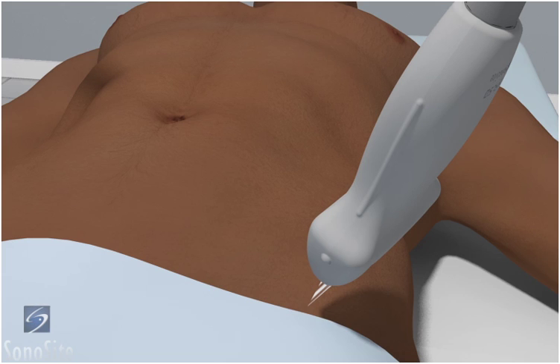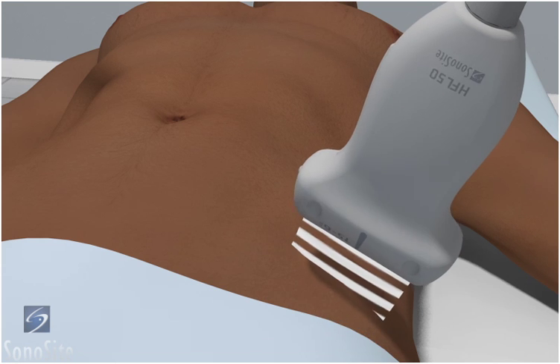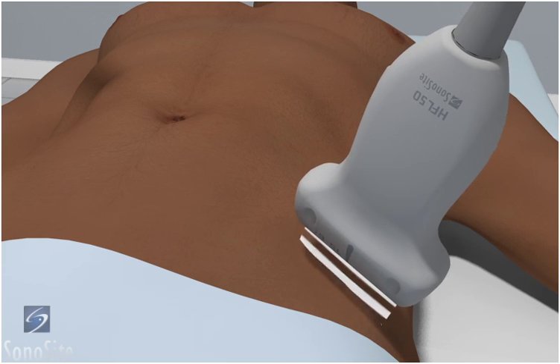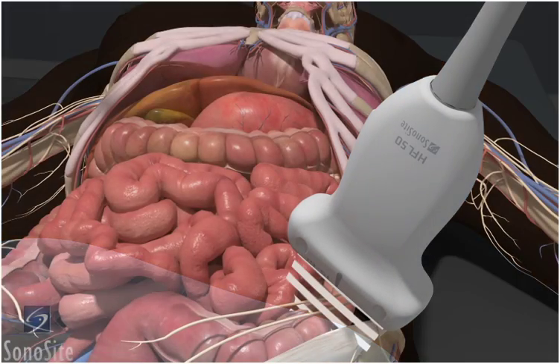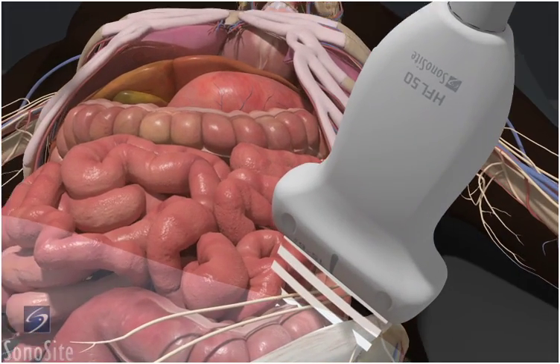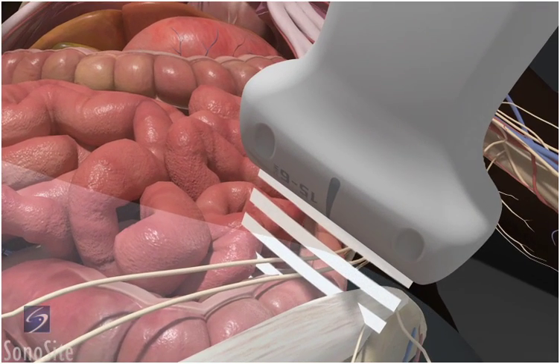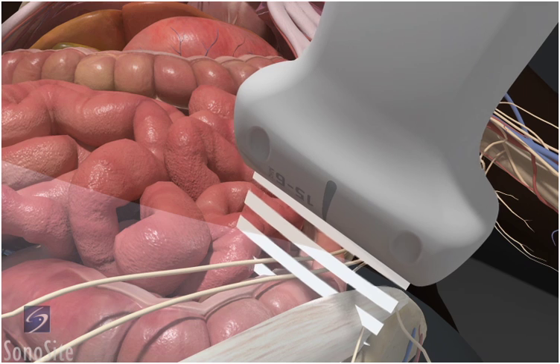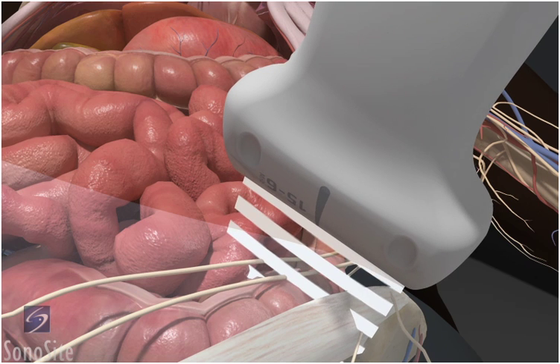The patient is positioned supine. The transducer is placed over the bony prominence of the anterior superior iliac spine with the orientation marker directed to the patient's right. The transducer is then rotated slightly counterclockwise so one side rests on the anterior superior iliac spine and the other side points at the umbilicus.